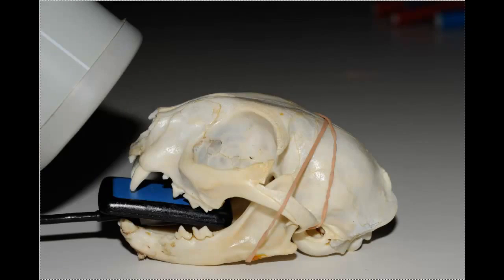Now, for radiographing the incisors and the canines, the front teeth, which are one of the easier, if not perhaps the easiest, shot in the mouth of a cat, we are now, because we're going for the front teeth, we have the camera point of view from the side. So we can see the angles of these teeth pretty much from the side.